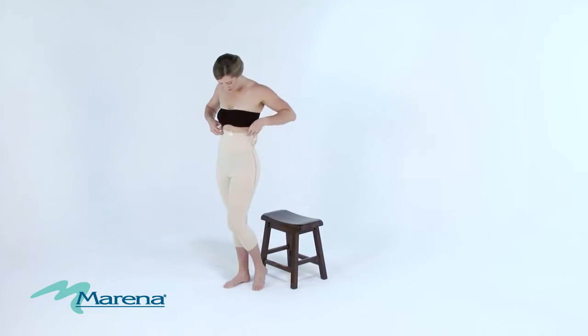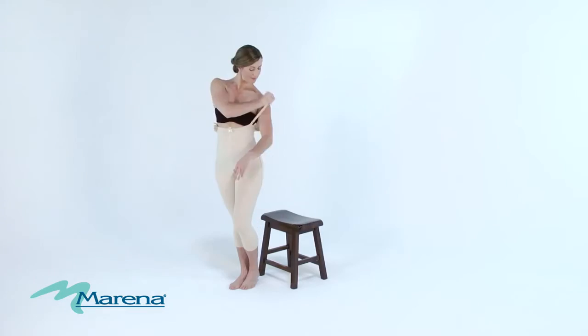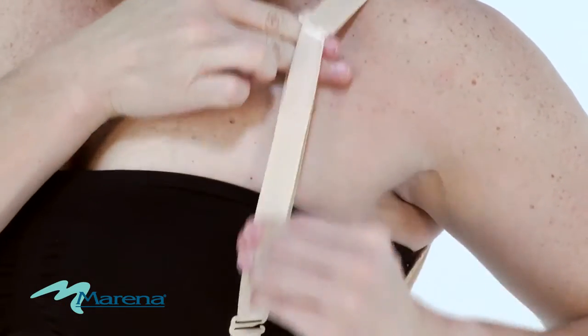To make sure the garment is underneath the bust, pull up on the center tab. Finally, place your arms through the shoulder straps and adjust accordingly.